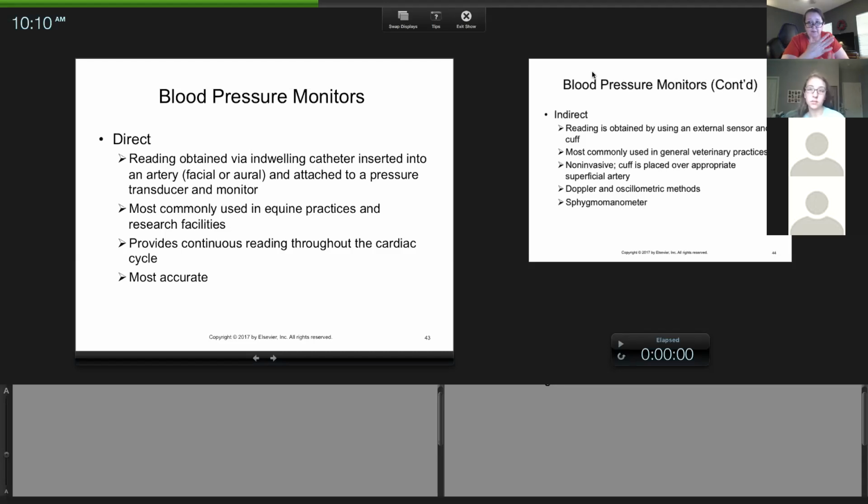And then if I say direct blood pressure, that is the catheter. I sent you a video. They were placing an arterial catheter.